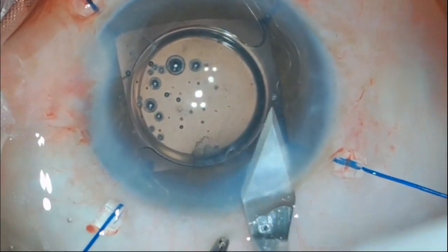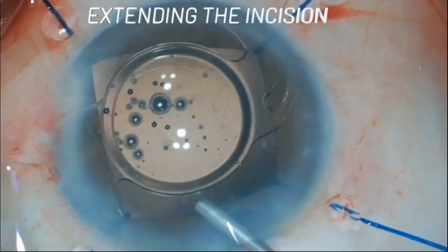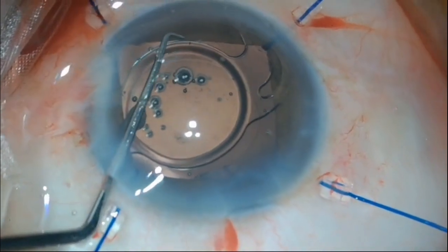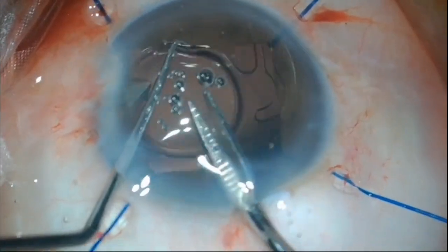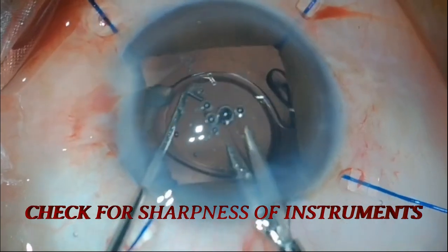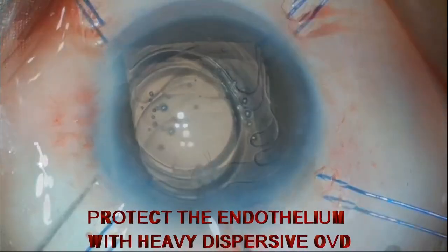The leading haptic is pulled out of the bag, and now the incision is extended at least 3.5 mm for safe removal of the IOL. Always check the instruments before use. IOL cutting forceps was blunt in this case. Use a heavy dispersive OVD to protect the endothelium.